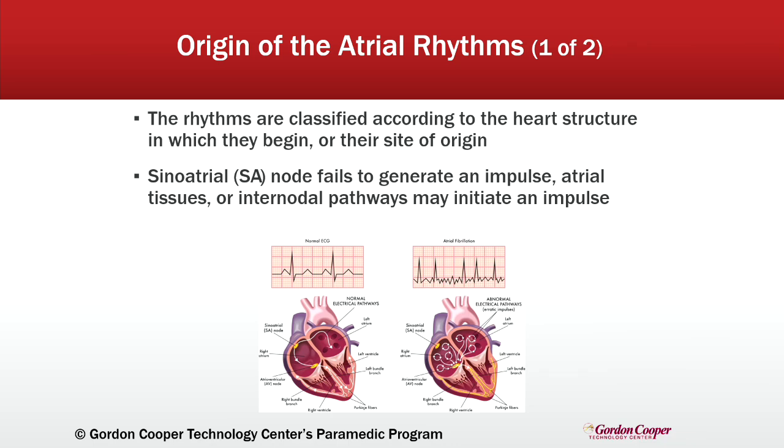So this is where things can get a little interesting, because now the electrical activity is coming from places other than the usual pacemaker, which can lead to rhythms that are different from the typical sinus rhythm. So we'll see how the heart tries to compensate when the SA node isn't calling the shots here.